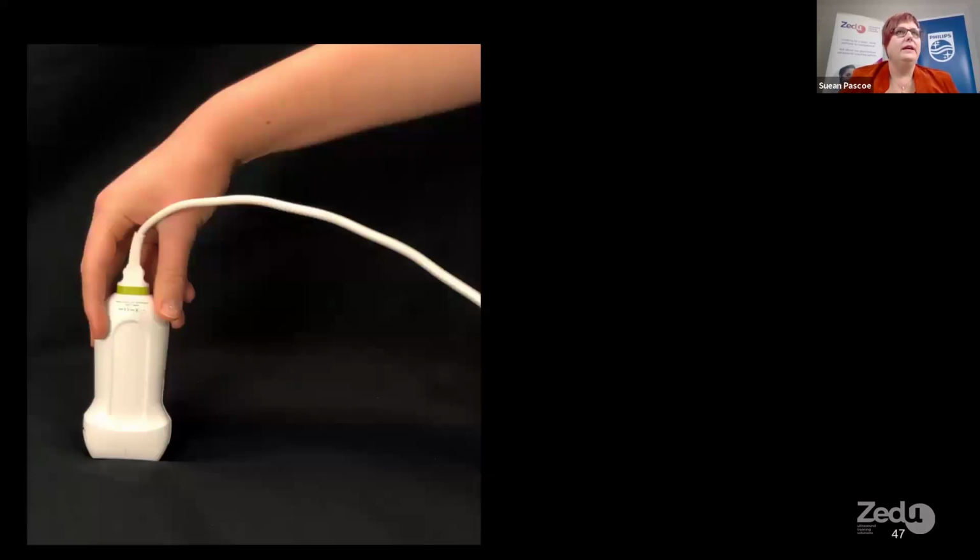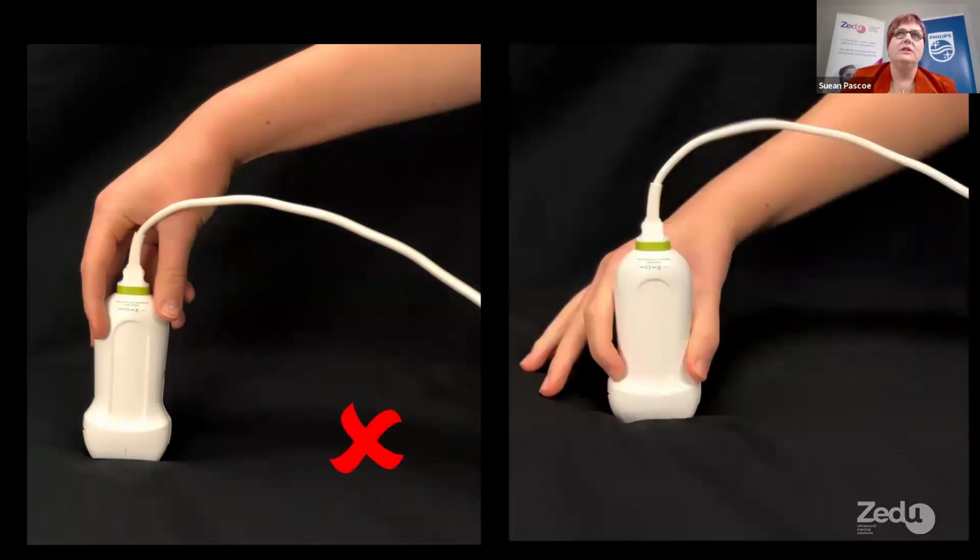The other common thing that can happen is that you're using a really poor grip on the probe. If you're holding the probe up high because you don't want to get your hands dirty or whatever, you're not going to have control of the probe face and you'll slip off very easily. So anchor your hand position, use your fingers, number 4 and 5, resting on the patient. Now you should be getting gel on your hands here. We haven't got a glove on in this case, but I always perform a scrotal ultrasound with the glove on, and so getting your hands dirty shouldn't matter one little bit. So keep your probe grip down quite low and anchor your hand position.